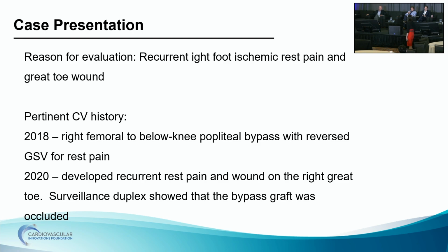Yes. I had a question, a second one. My opinion, my experience, if you have an occluded bypass graft, just like an occluded vein graft, if it's acute limb ischemia, you've got to treat it on the spot. Otherwise, that's the one time I think thrombolytic catheters make your life a lot easier. They get rid of all that clot, and usually you can focus on the problem, which is, as you said, the distal anastomosis, and that can usually be treated pretty well endo rather than a graft revision the first time around. What do you think about lytic catheters if they're not acute limb ischemia?